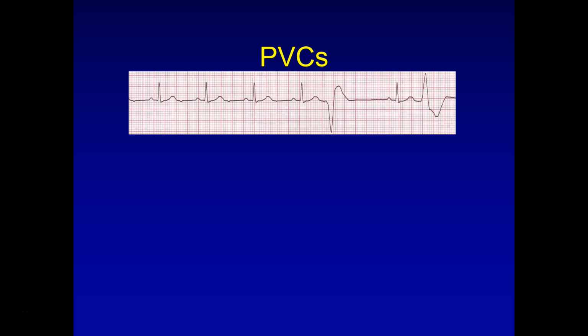Lead 2 consists of two electrodes. The negative electrode is put on the patient toward the right limb, the right arm. And the positive electrode is going to be down toward the left leg. And so in normal conduction, the impulse is going to move toward the positive lead, always. And due to the location of where lead 2 is placed, looking at the inferior wall of the heart, as the electricity moves down toward the positive lead, the positive lead, in turn, when it receives that signal, is like a camera that looks back up toward the direction of the negative lead, and that's what ends up being the tracing on our EKG paper.